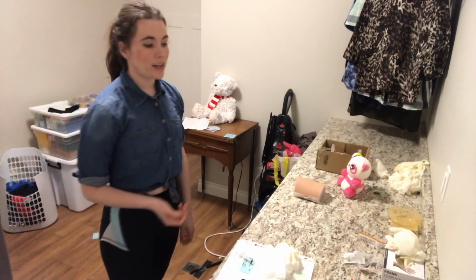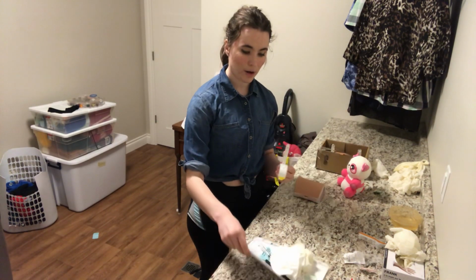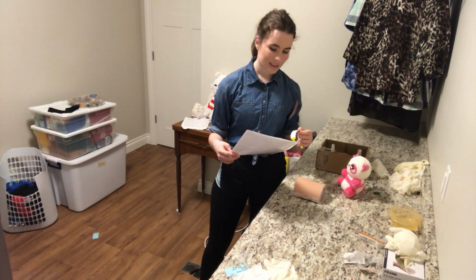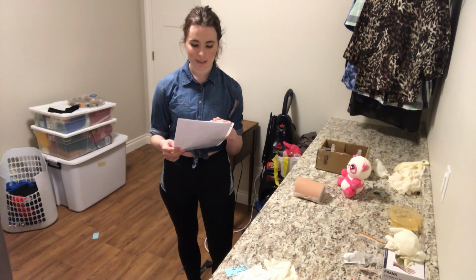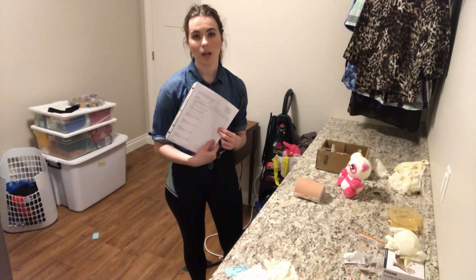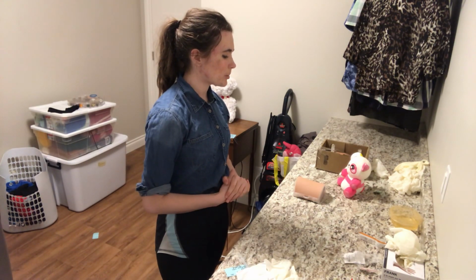So now that I have checked all of that, I'm going to go down to my patient's bedside and I'm going to ask them to state their name. So can you please tell me your name? Jake Nursing, and I'm comparing that with the MAR and with the wristband. So what is your name? Jake Nursing. What is your date of birth? January 1st, 1960. And I also see that the FIN 312, 654, 9797, and the Dr. Skills Lab all matches up. And Jake, do you have any allergies? My patient says they have no allergies, and that matches up with our MAR, so we know this is the correct patient. So Jake, I'm going to do my last check up on the top of your bed, and then I'm going to come down to you and kind of tell you a bit about the medication, okay?